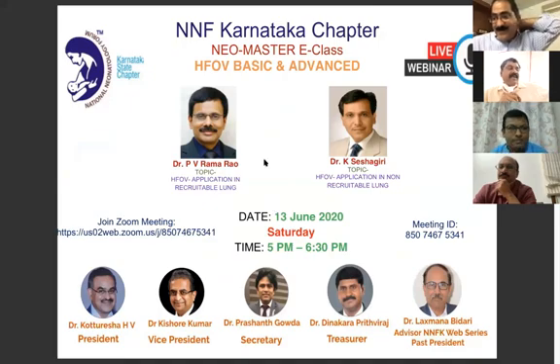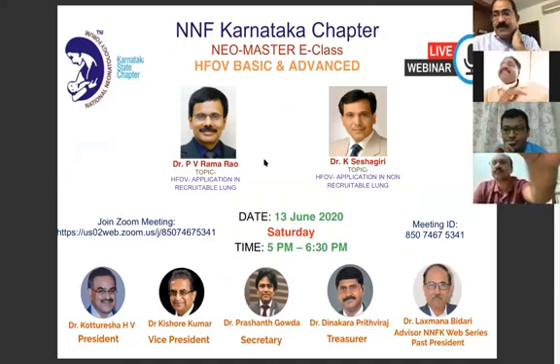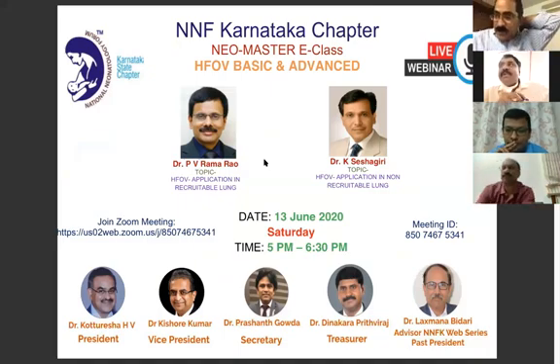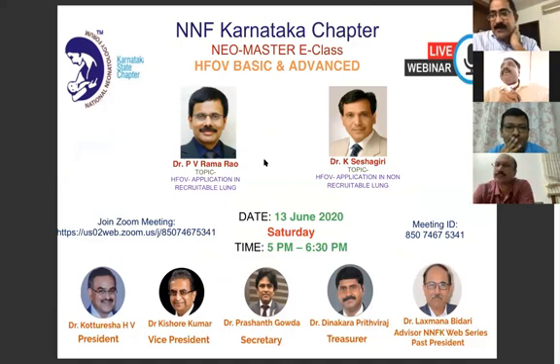Sir, how to choose the optimal frequency? How are you going to know? Only in the books we read: if it is a small baby, keep 12 to 15; if it is a late term baby, 10 to 12; if it is a bigger baby, less than 10. Sir, is there anything on how to choose the frequency?